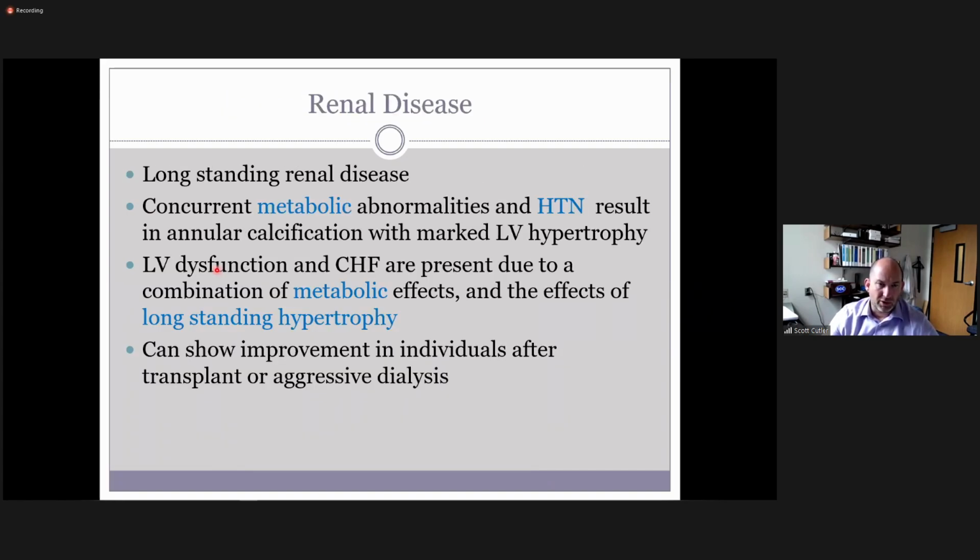Again, if you're doing IVRT regularly, you've already got the data, you've already got the image. It's not hard to add that as a myocardial performance index. So just remember that that's going to apply to the function of it.